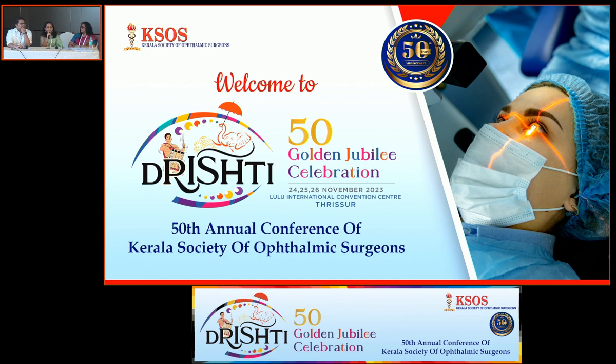The most common question we encounter during presentations on gonioscopy is which gonio lens to buy. When you are a beginner, always go with a gonio lens which has a coupling solution, either the Goldmann three-mirror or a single mirror lens, because that gives you stability while doing gonioscopy. Do gonioscopy not only for narrow angles, do it for all patients in the beginning. Take lots of myopic patients and do gonioscopy, and you get to see all four structures very clearly. Once you do it on 10 patients, you will know exactly what it looks like, and you will never miss any and won't have any doubt.